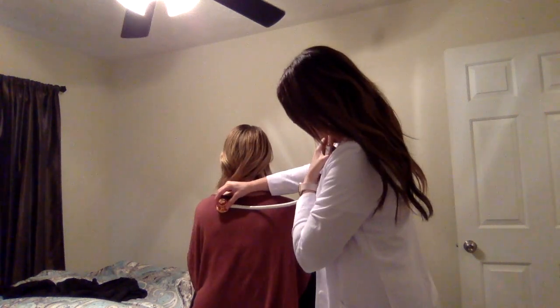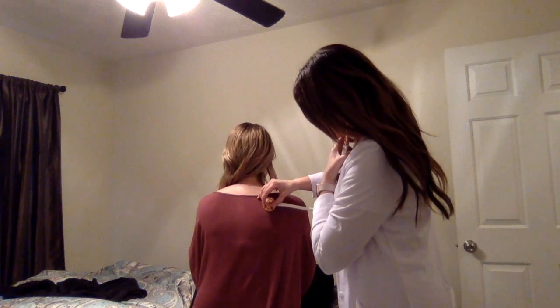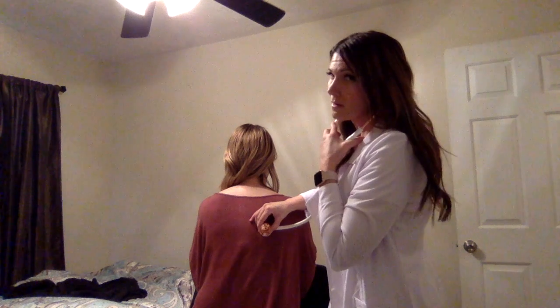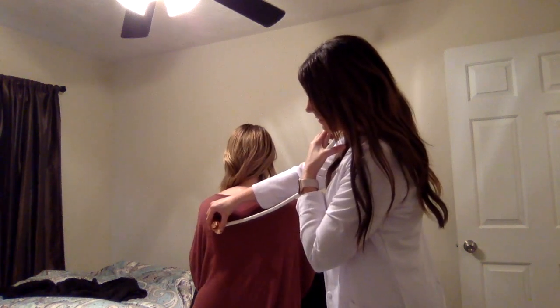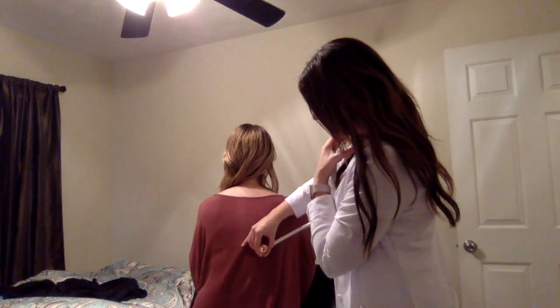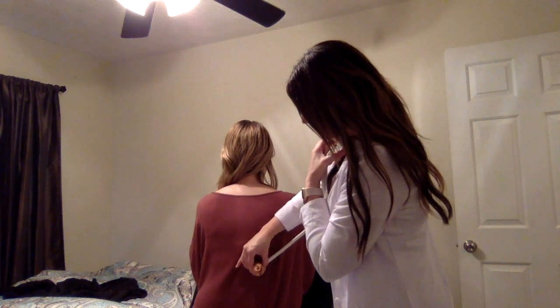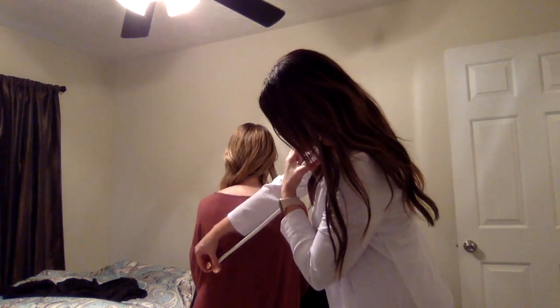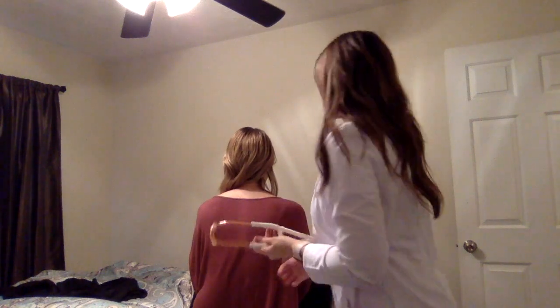Okay, take a deep breath for me. Take a deep breath for me. Again. One last time. And good job. Okay, you can turn around for me.